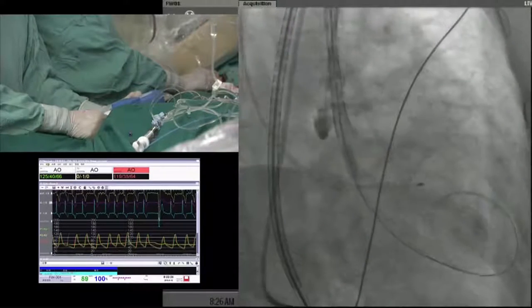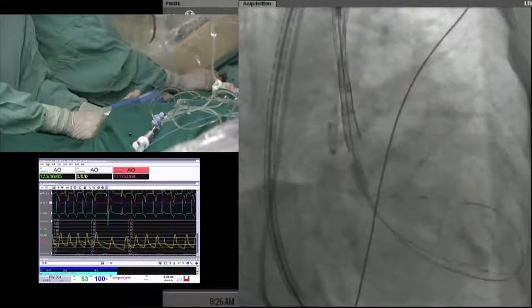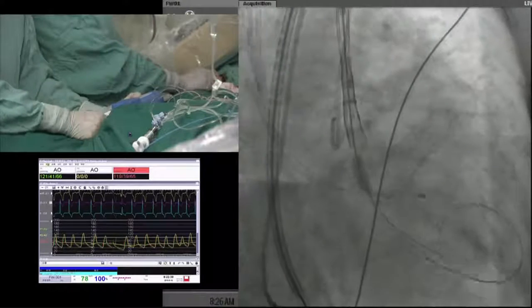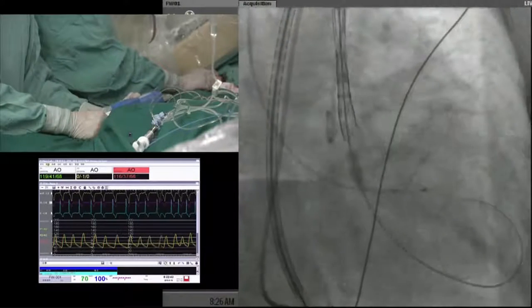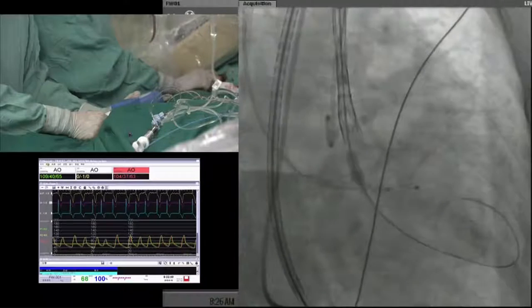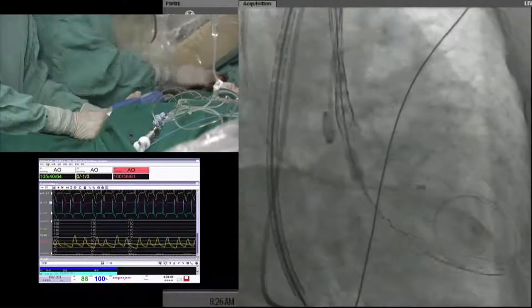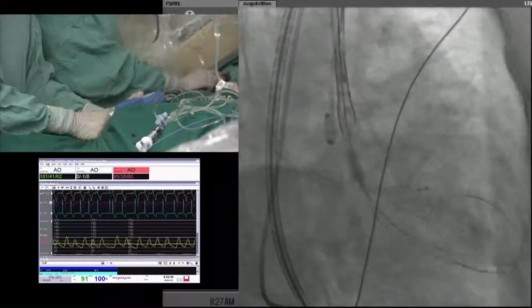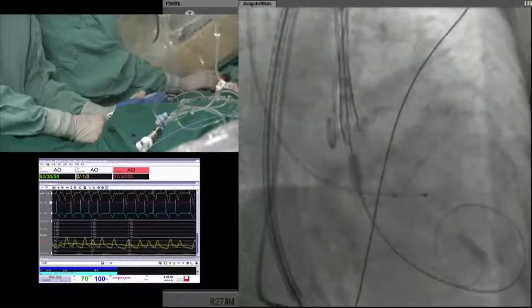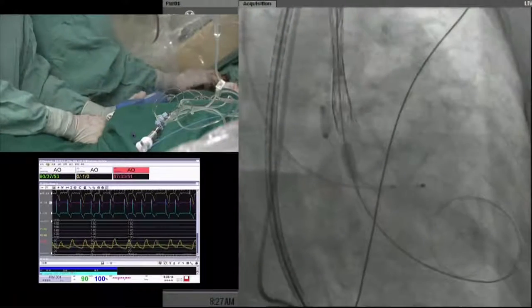You see, the valve is not totally open at the distal end. That means the calcification is very difficult. It's like it's still a very stenotic valve. We should wait. If it's not opening, maybe we should recapture. We should make the pre-dilation again. You see? It's really just not opening up very well. Very calcified valve.